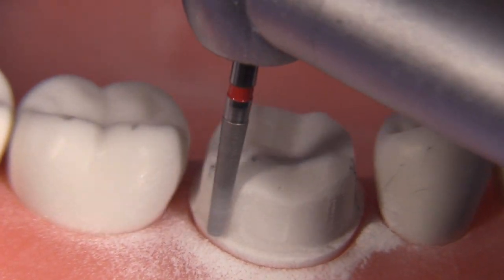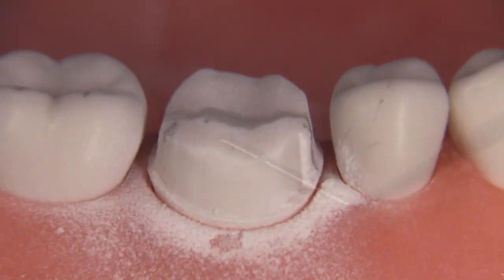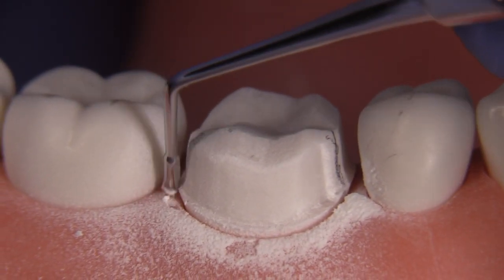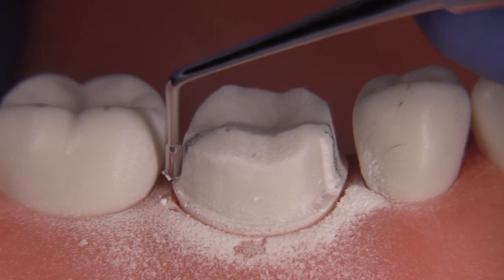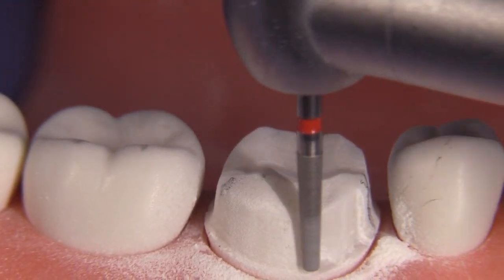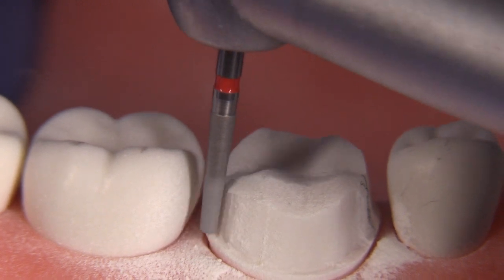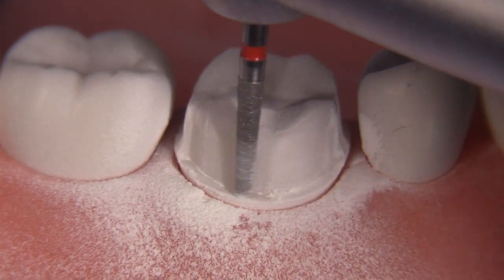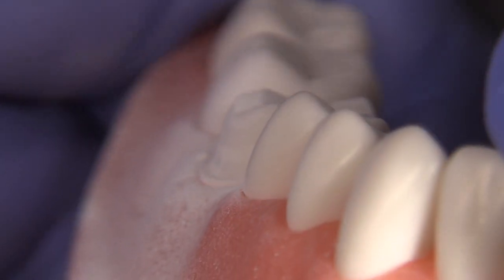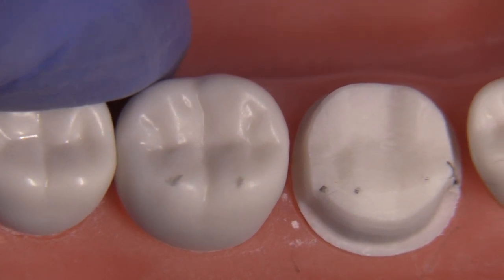Every time I'm doing action shots here I'm speeding them up 2x so that we can get through these preparation parts more quickly. It's a good idea to get out the RGS3 as another way to verify — have you gone deep enough? Not even close. You've maybe made a shoulder but it's not deep enough. On the mesial it looks good but in the mid and distal buccal area it's definitely not 1.1 millimeters deep, so we continue. Remember every time you deepen the shoulder you'll want to reestablish the taper and even reestablish the secondary plane, which you may have removed in the process. This is also a good time to smooth off the finish line and get the proper shoulder, which makes a 90-degree angle between the finish line and the unprepared tooth structure.